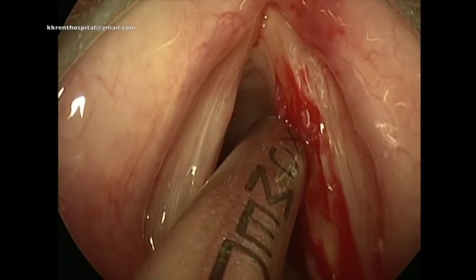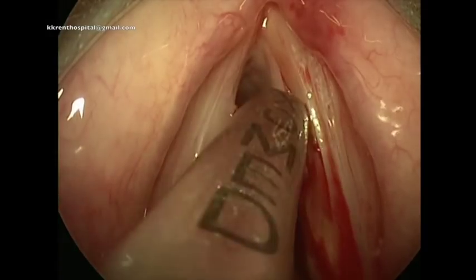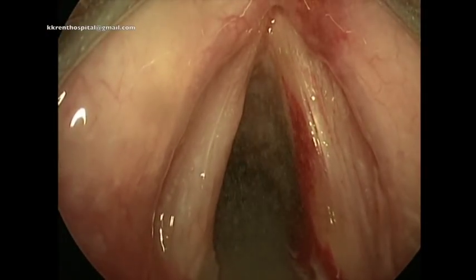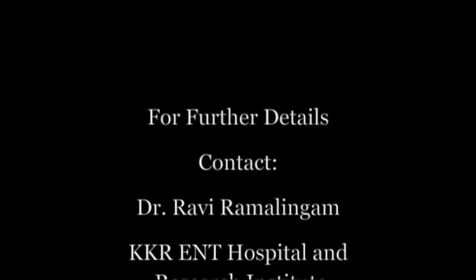After the excision, any small remnant is skimmed using the laryngeal skimmer blade made by the Medtronic or the Zomet company. This is how the vocal cord looks at the end of the procedure — a complete excision. Thank you for your attention.